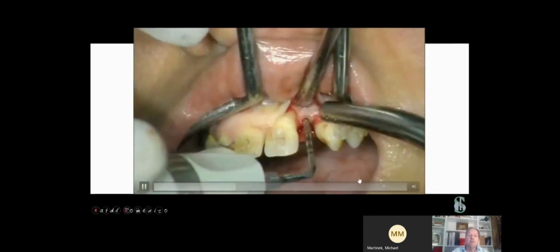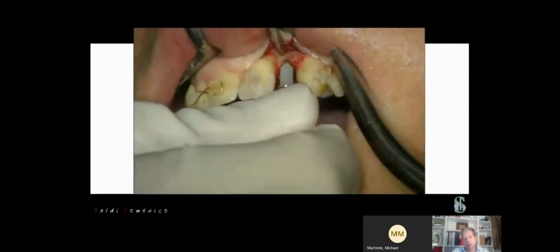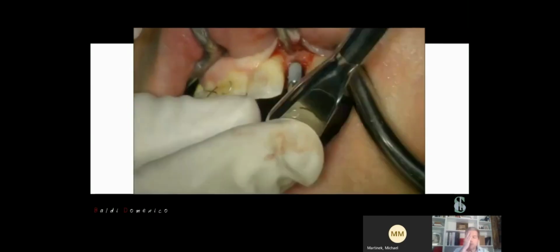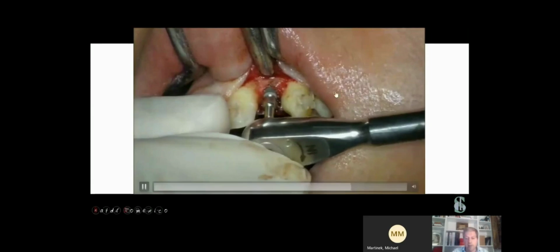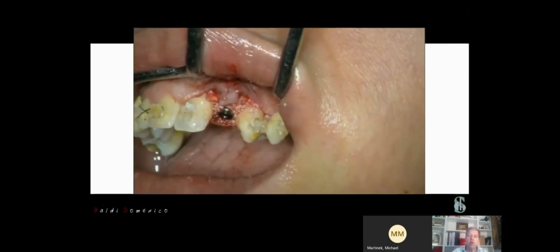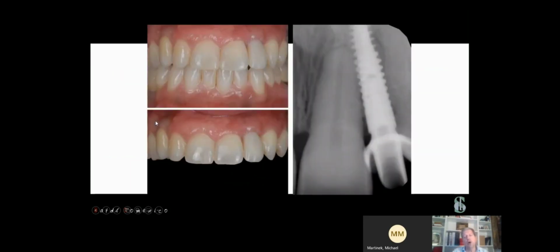But as you can see, it was possible to consume the bone without obtaining an expansion of the bone. And this is the difference between an ultrasonic application, an ultrasonic surgery, and a magnetodynamic surgery. In this situation with the magnetodynamic, it could be possible to obtain a perfect, atraumatic preparation with an expansion of the bone. But you can see the healing of the soft tissue with the temporary crown, and the final work with a good healing of the soft tissue and, of course, of the hard tissue.